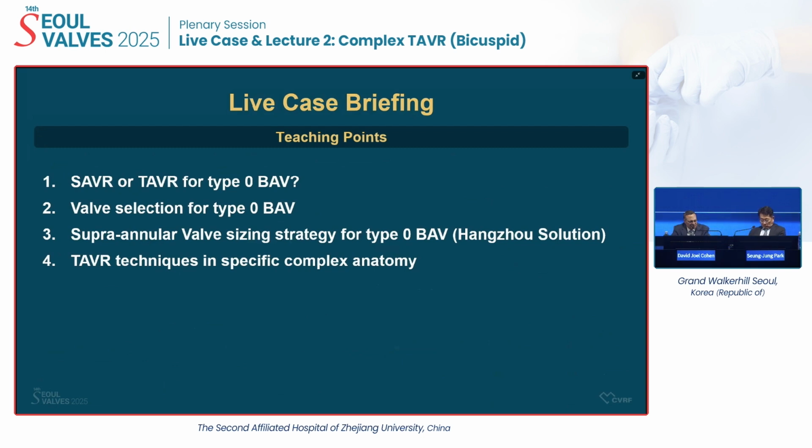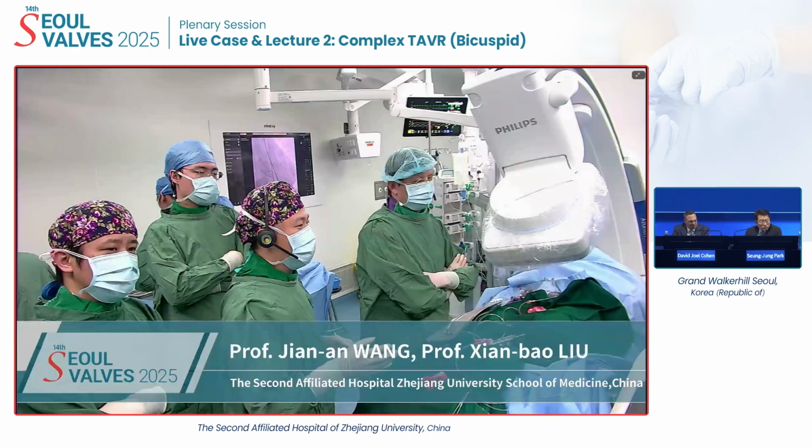For this patient, we spent a lot of time crossing the valve with the wire. It's not easy to manipulate. Okay, that's all for the case presentation.